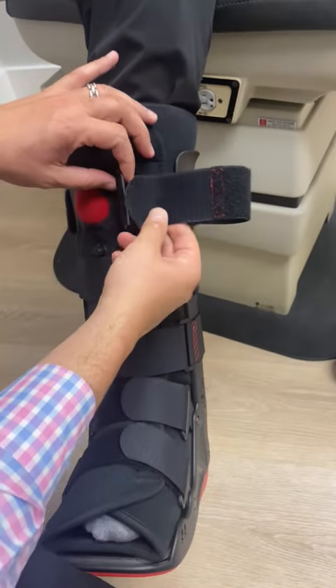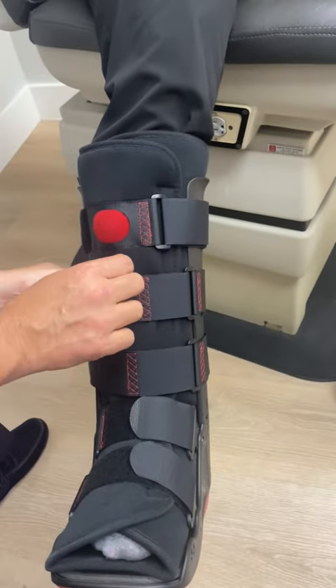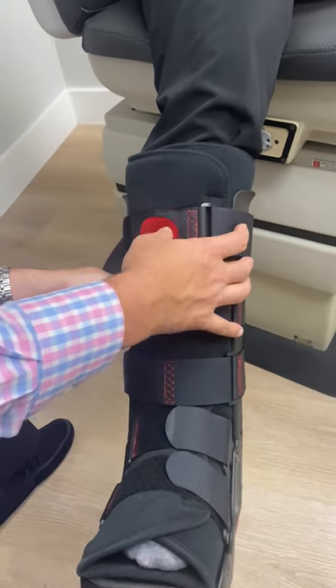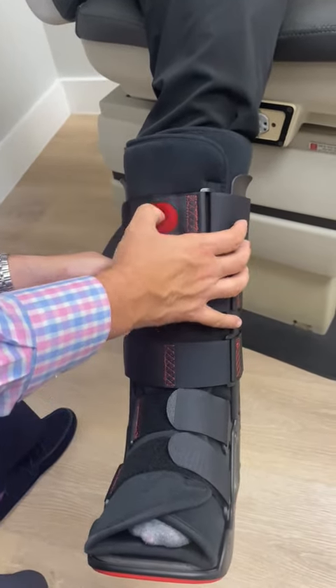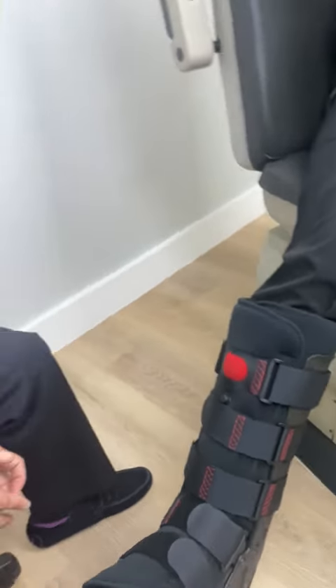You don't want the boot to be too tight either. The idea is you can fill it up, but it doesn't have to be so tight where you feel like you're cutting off your circulation. Just tighten it up enough to help fill the space. And that's how you take it on and off.